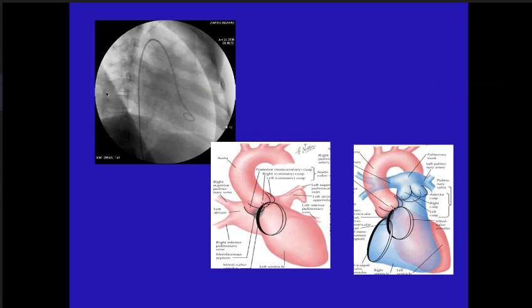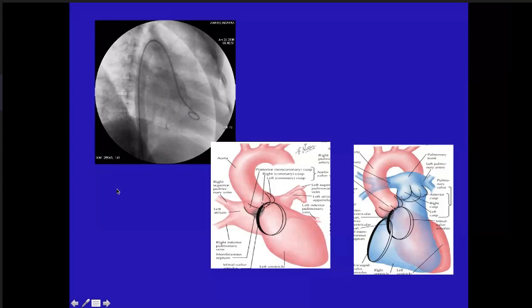So now we come to the ventricular angiogram. What view is this angiogram? Steep RAO cranial. Only AP, lateral is left, and then caudal is left. Steep RAO cranial, sir.